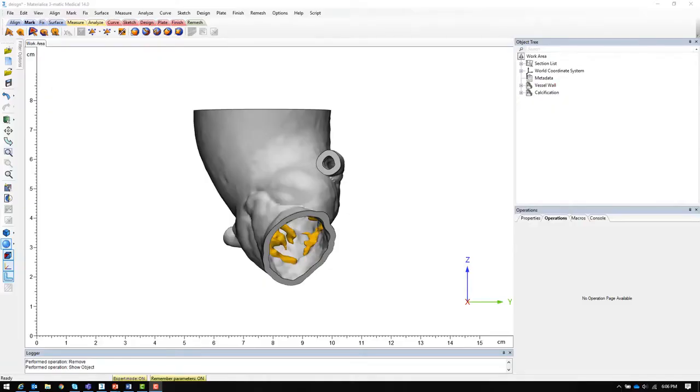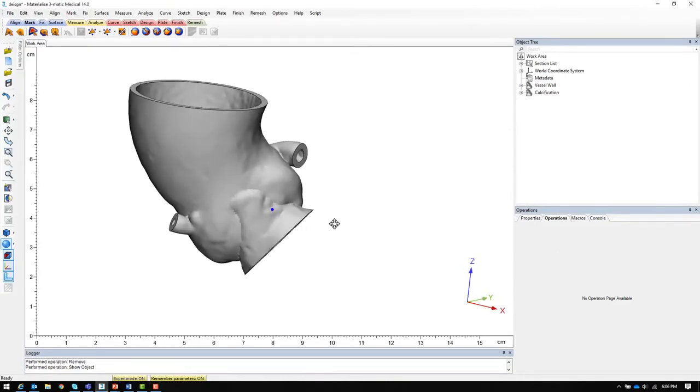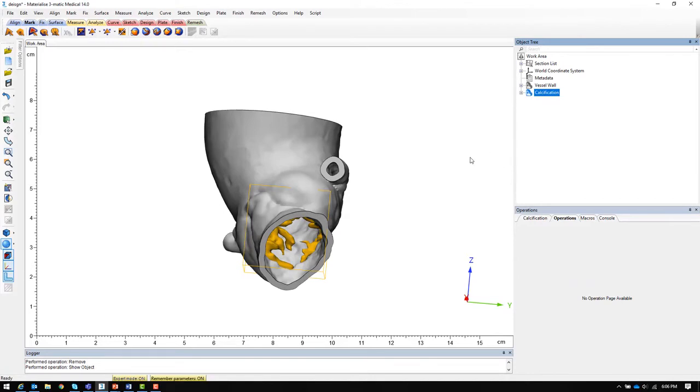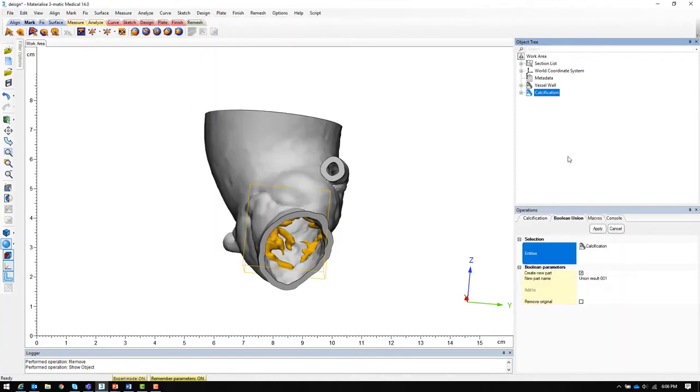First let's take a look at the multi-color method. Here I've already segmented an aortic root including the vessel wall and calcifications as separate models. In this case, the multi-color method, we will want to combine these together into a single model file. We will use the boolean union tool, select both parts and apply.